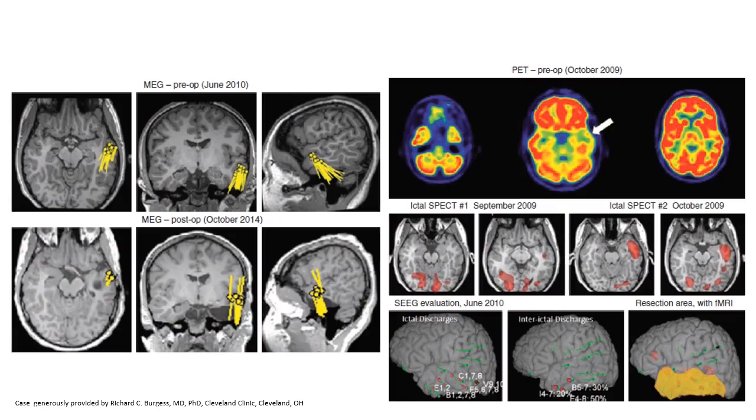Below that PET image are 2 conflicting results which were found from the 2 SPECT scans. The first is the bioccipital one, where the red regions can be seen greater in the right than the left brain. And the second is showing that there is more left lateral temporal areas active. Because of the non-concordant data and concern about left temporal language, the patient had an invasive evaluation with a stereo EEG at age 15.